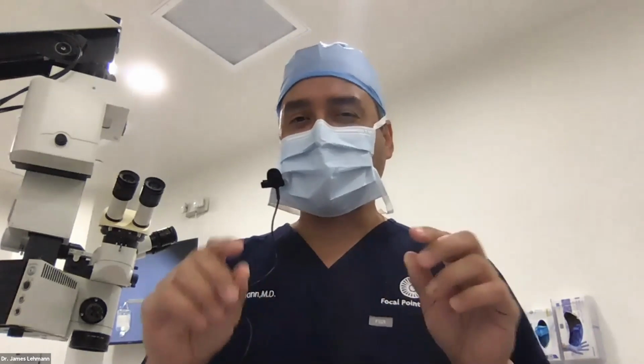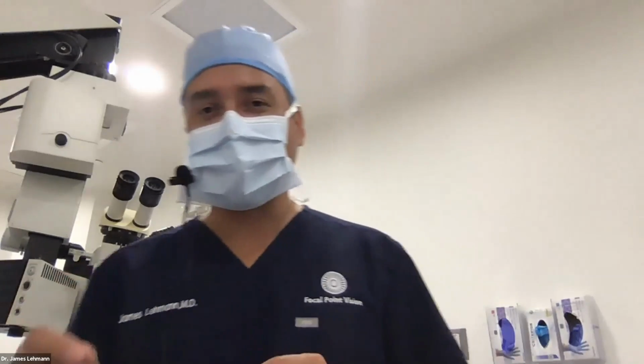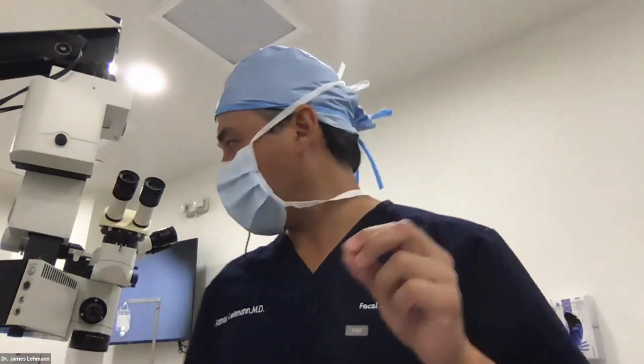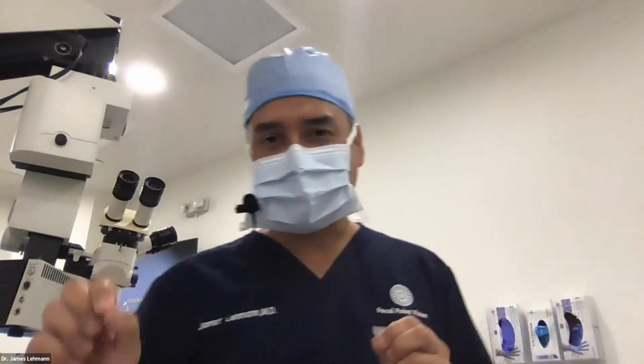Okay, Dr. Mortazi again, how much moxifloxacin do you inject intracamerally? I'll have to get you the exact dosage, but we put about 0.2 cc's. But the dosage of it, I'd have to ask my nurses on that.